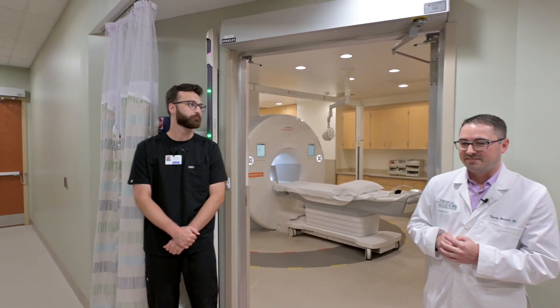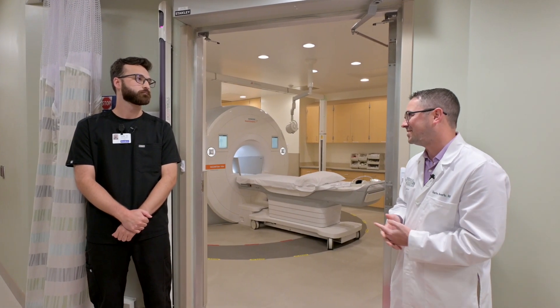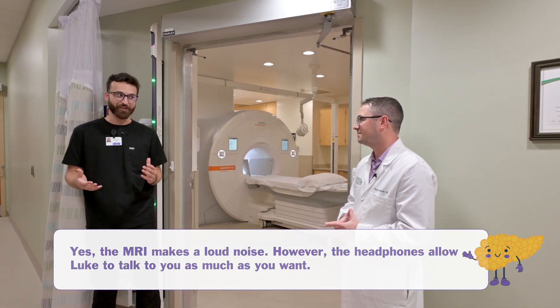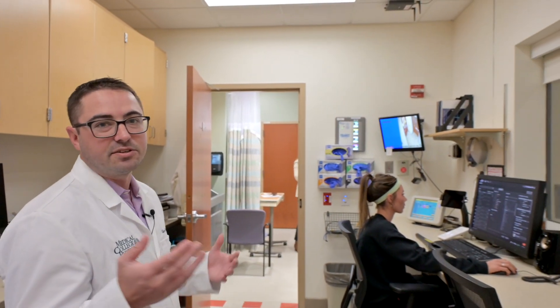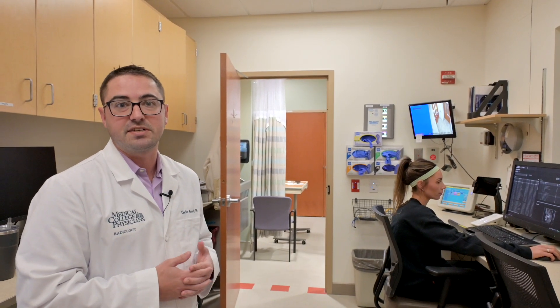One last thing about MRI: it's very common for people to notice an extremely loud noise throughout the duration of their scan. That's our gradient coils rapidly expanding and contracting — it's necessary for us to get the images. That's why we always provide hearing protection and headphones. Unfortunately, there's nothing we can do about the noise, but if we can offer music, that's what we'll do to help take your mind off of it. Here in the technologist room, they work on the computer and set the imaging parameters the magnet will use throughout the scanning time. There's a window where they can see the patient, and the whole room is outfitted with microphones and cameras to allow the technologist access to the patient at any given time during scanning.